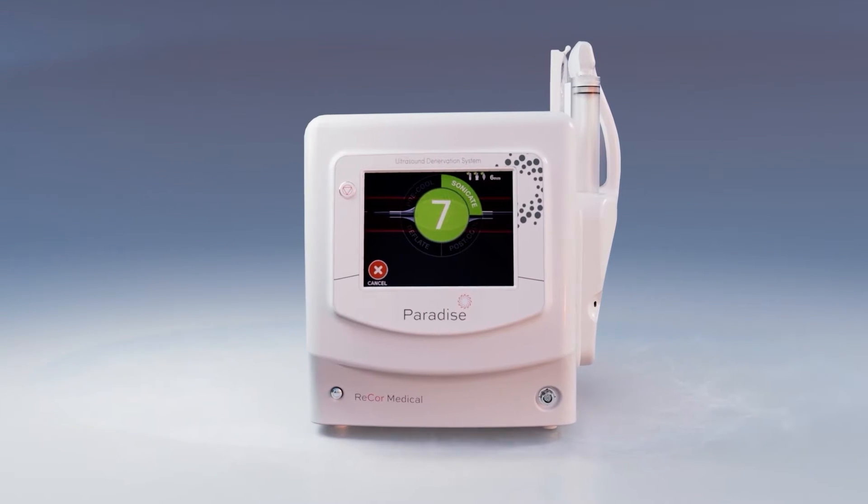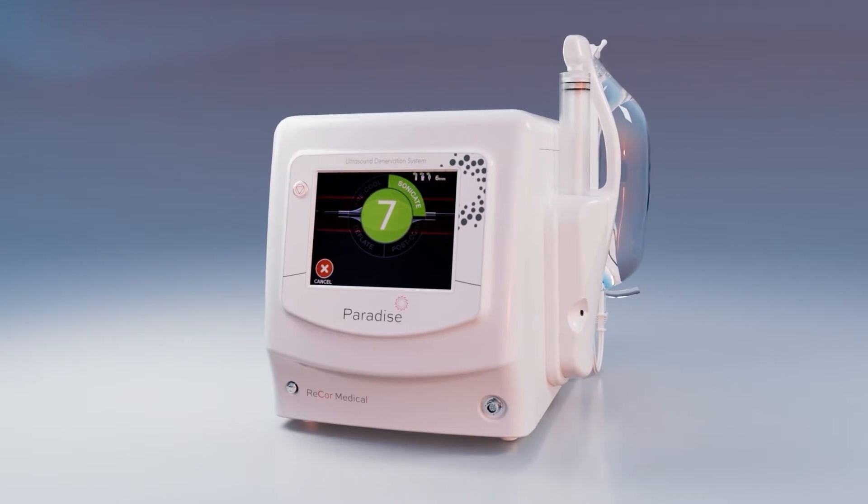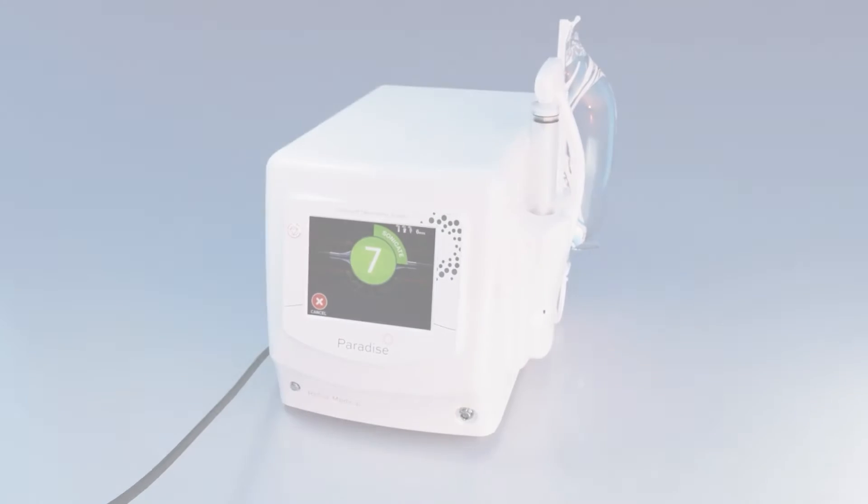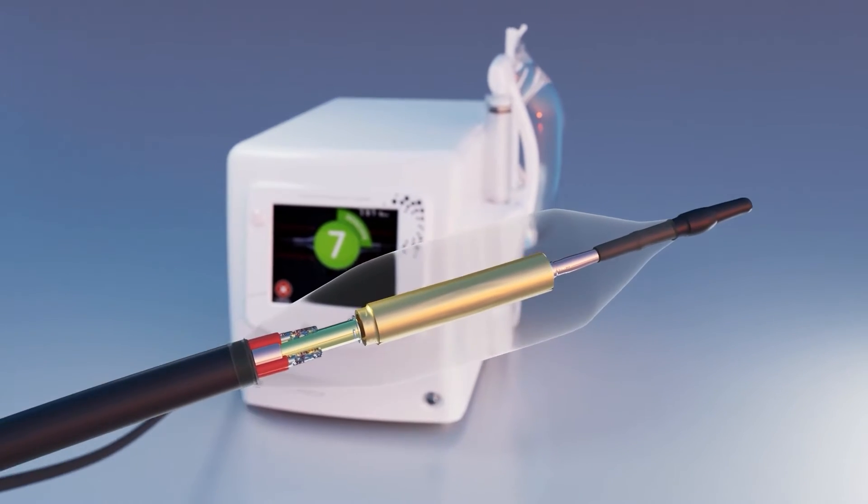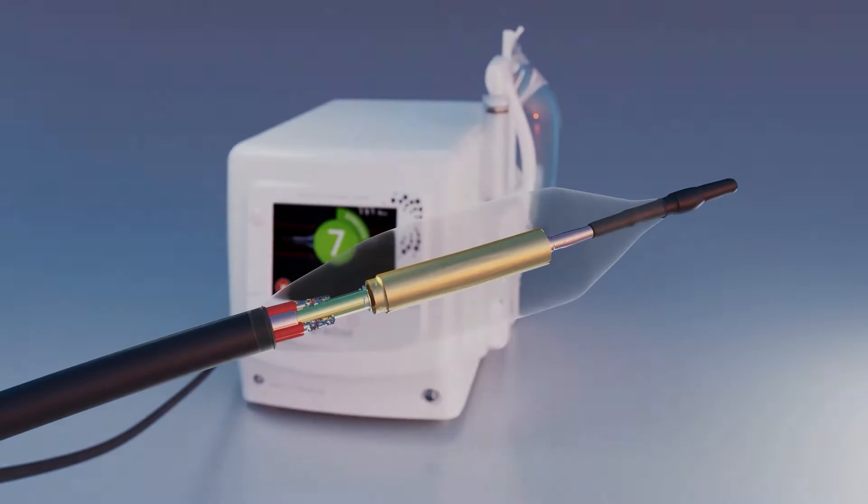The generator interface provides a clear stepwise plan for a streamlined procedure. With three successful randomized sham controlled clinical trials, the Paradise Ultrasound RDN system has shown significant blood pressure reductions in patients with uncontrolled and resistant hypertension.